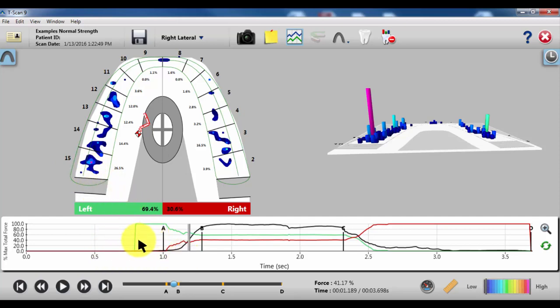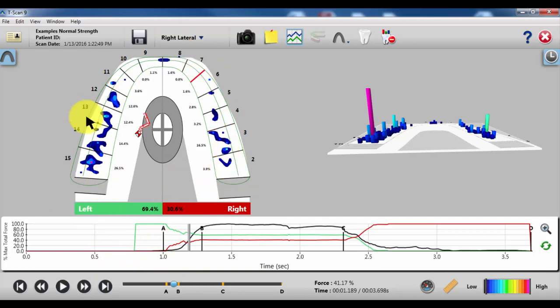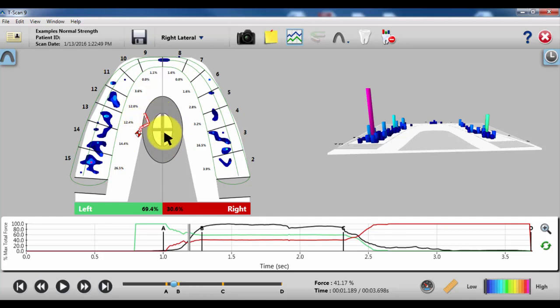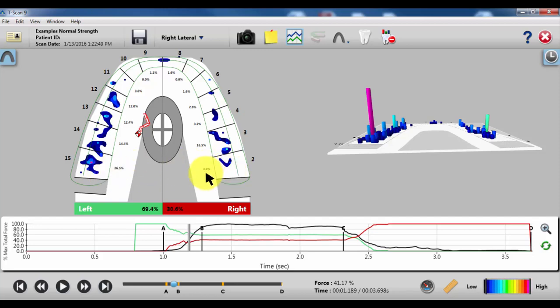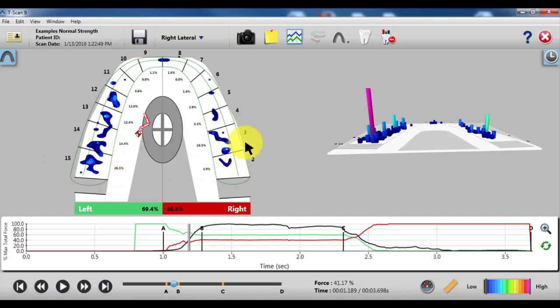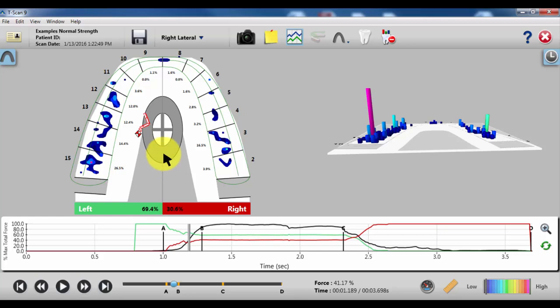A final scenario that you would like to see, in this case patient tooth 2 through 15, assuming they have good dentition and are fairly healthy. You want to find the center of force icon moving and drifting towards the middle. You want to see better overall left to right balance. And you want to see the teeth, for example, 2 and 15, have similar forces in percent. So right now tooth 2 has 3.9% and tooth 15 has 26.5%, a pretty large discrepancy at this point. If those three things line up, you should have a better, more balanced bite.